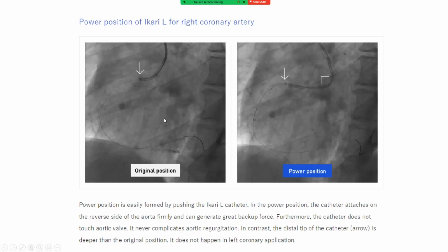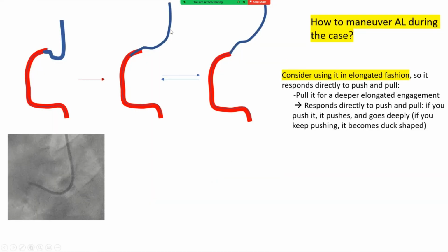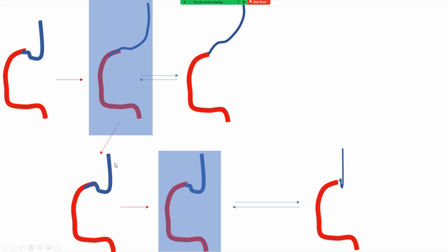Like I explained, you can do somewhat the same thing with an Amplatz Left. With an Amplatz Left, you can use that elongated morphology and pull it for ostial maneuvering, then push it for distal maneuvering, and you can even push it more to make it duck shape and deep for distal maneuvering.